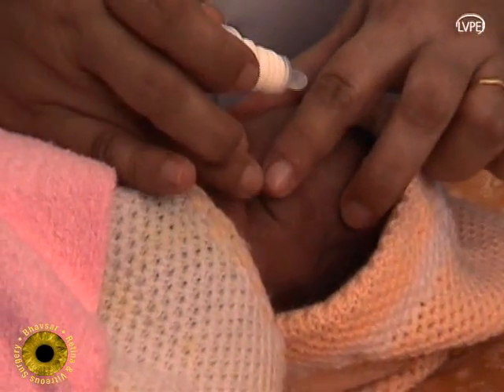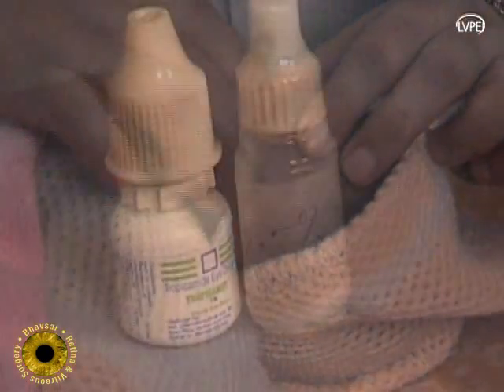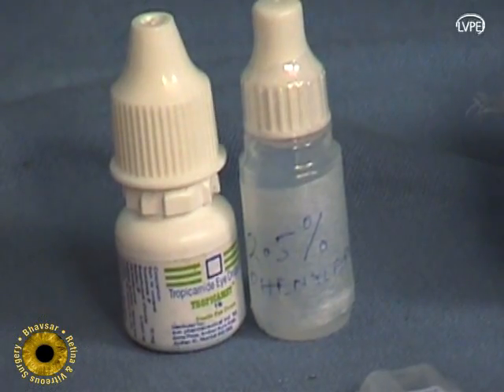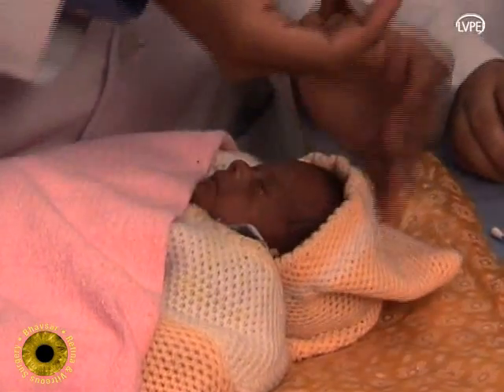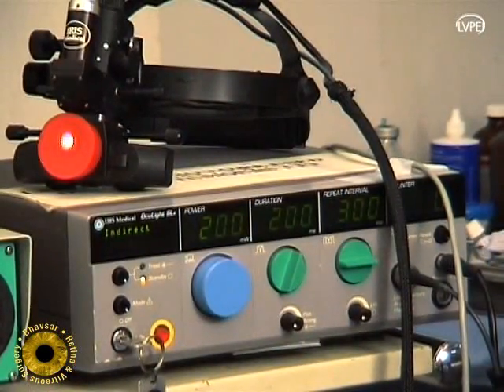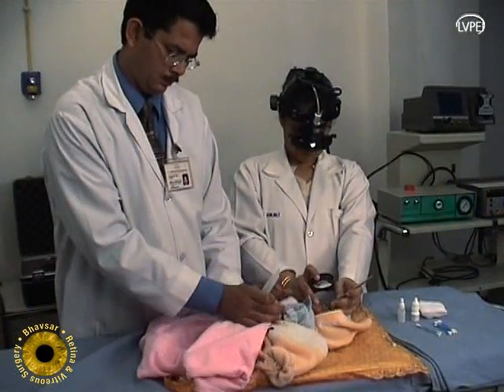The pupils are dilated using 1% tropicamide and 2.5% phenylephrine, two doses ten minutes apart. Topical paracaine eye drops are then instilled.